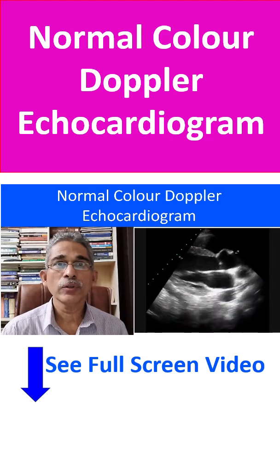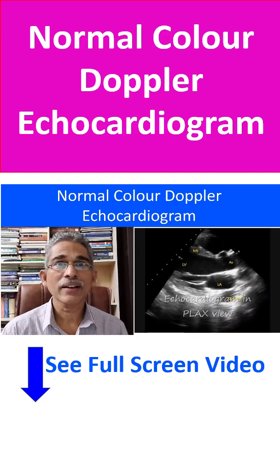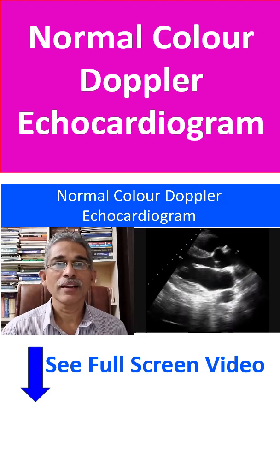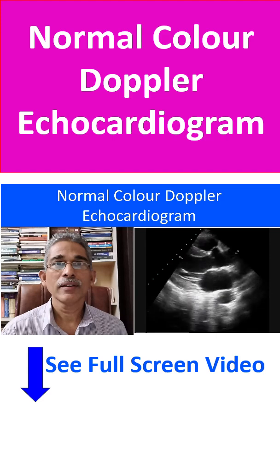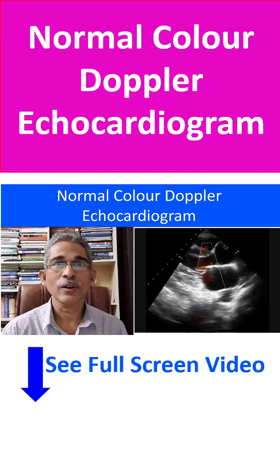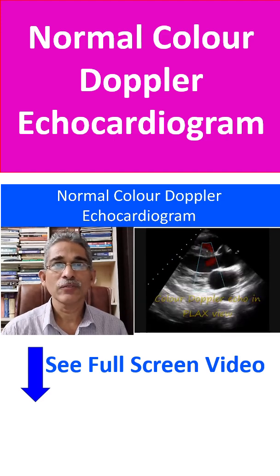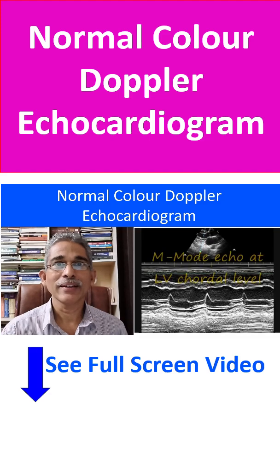We will review a few video clips from a normal colour Doppler echocardiogram in multiple views, like parasternal long axis view, which is the first view often obtained in adult echocardiography, parasternal short axis view, apical four chamber view, and suprasternal long axis view.